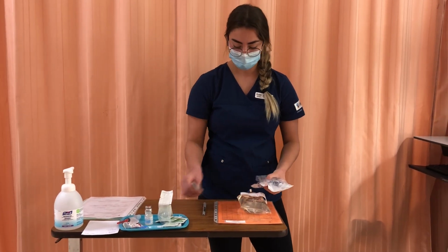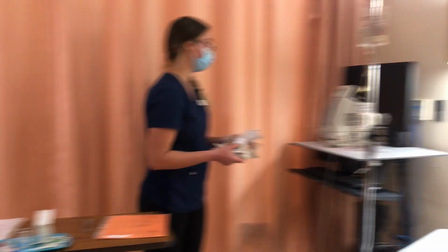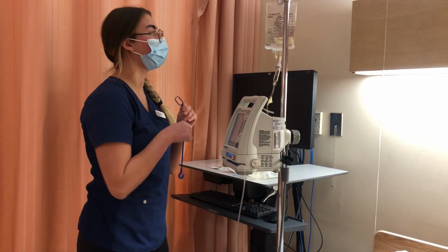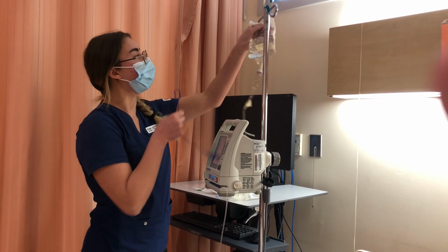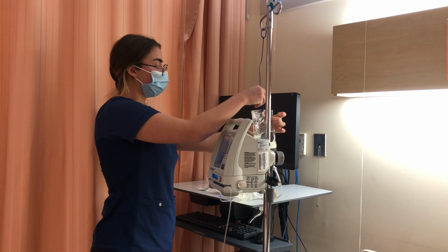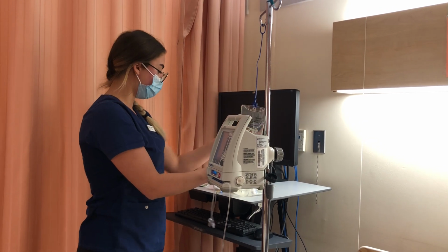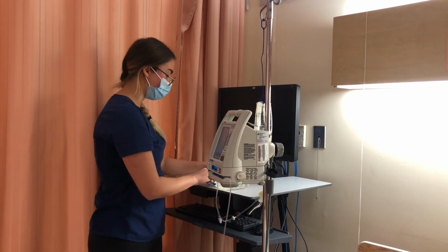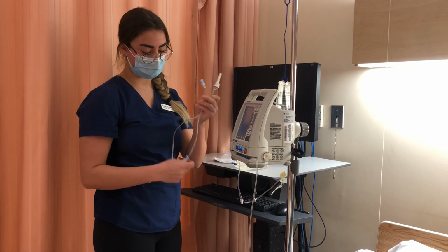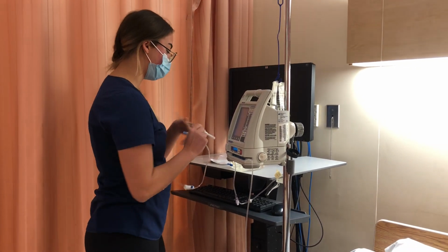So we are under the maximum dose and in the proper range. And for reconstitution, okay, so the first thing I'm going to do is lower my primary bag. Volume of 5 mL and in concentration of 1 million units per mL. And then I can spike my mini bag. To 100 mL of, so I'm going to make sure that my tubing is clamped. Over 15 to 30 minutes.